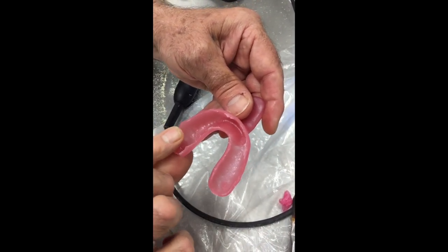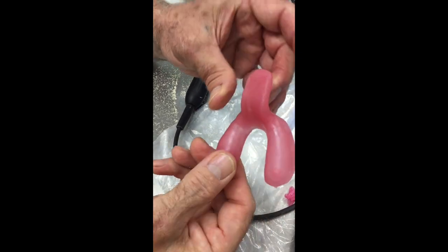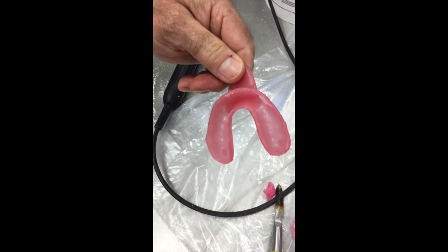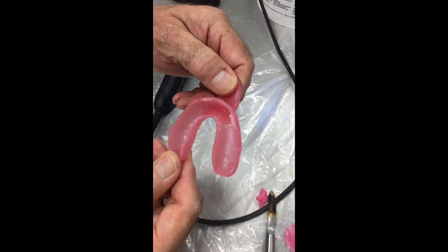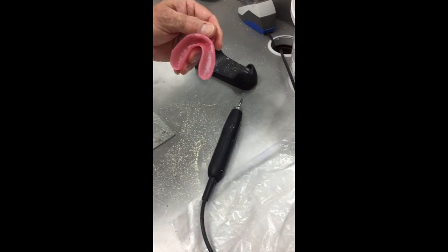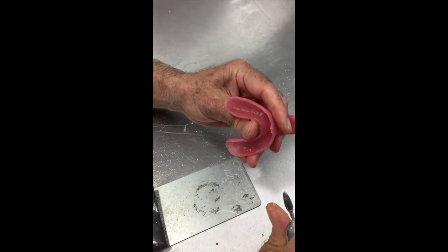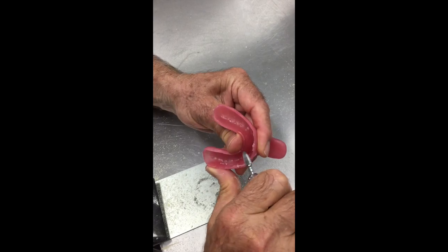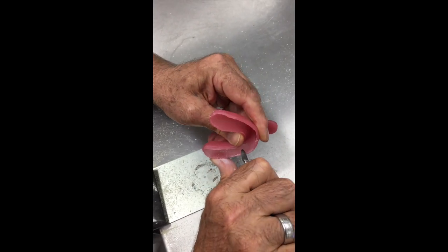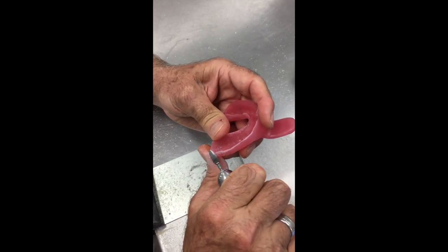Now, it's a simple process for us to just go around and remove any little sharp edges of that tray, and we have a nice, smoothly finished tray like so. And that's quite presentable and can be easily constructed in any dental surgery using this light material. So I'll just run around the periphery so that we can see exactly how we would do that, just using a standard cross-cut flame-shaped burr.